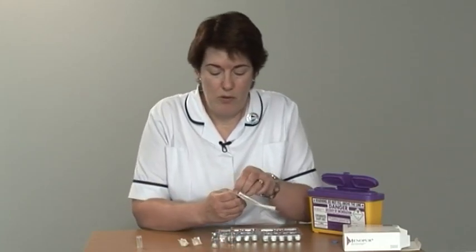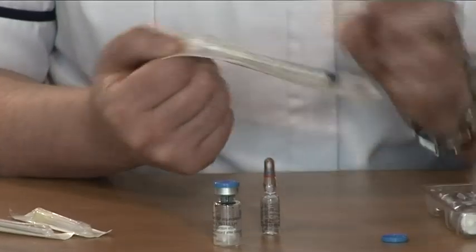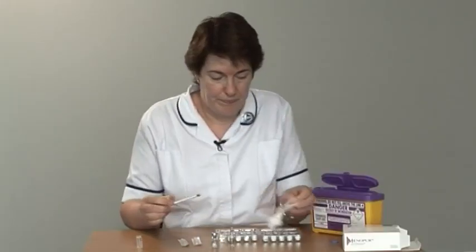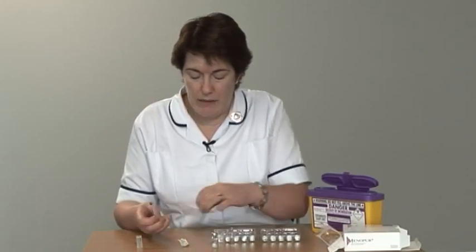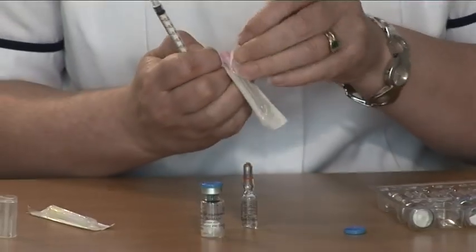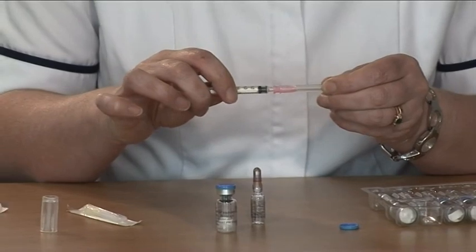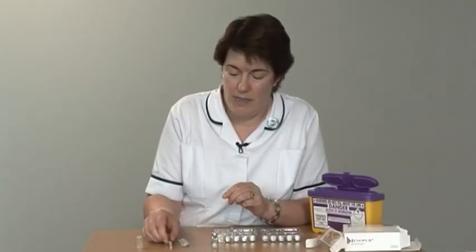In order to prepare your needle and syringe, ready to mix the drugs, take the packet with the syringe in and peel it open. Take the pink needle and again peel the packet open and attach the needle onto the syringe, pushing it firmly on. This is now ready to mix the drugs.